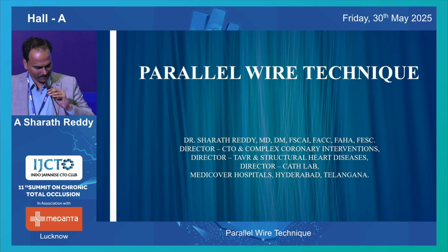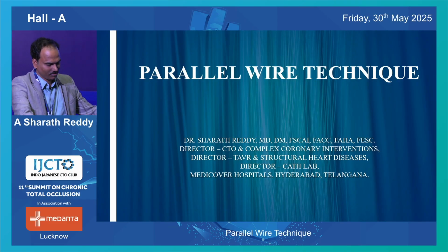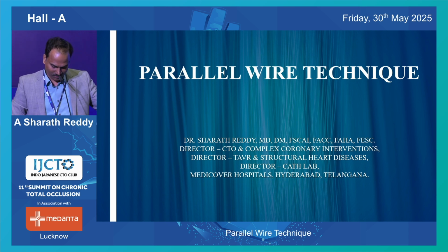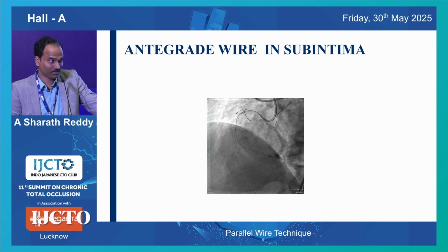While doing antegrade wiring, intentional intimal tracking is something we have been talking about since the beginning of this session. But however good your intentions are, you might end up like this, even with your first wire. This is a Fielder XTR in a mid-RCA CTO. You can clearly see it is subintimal.